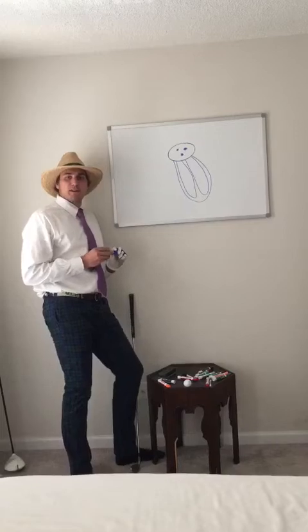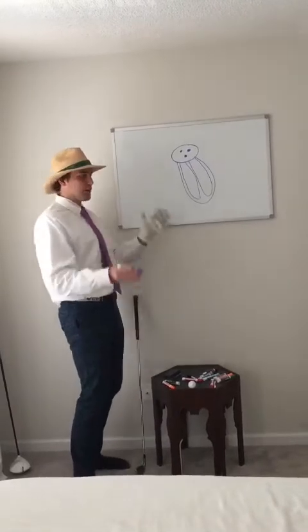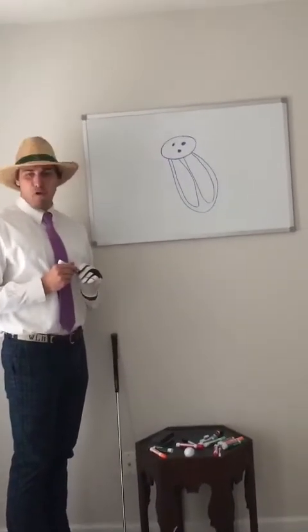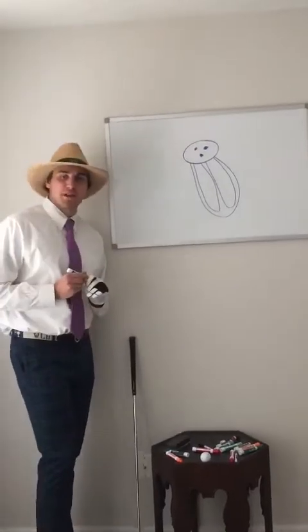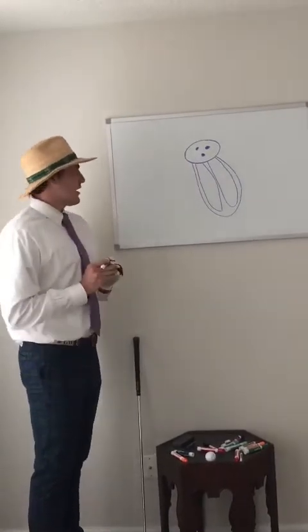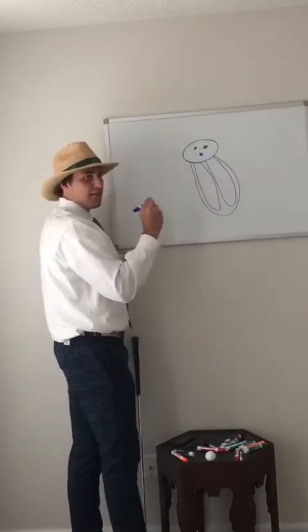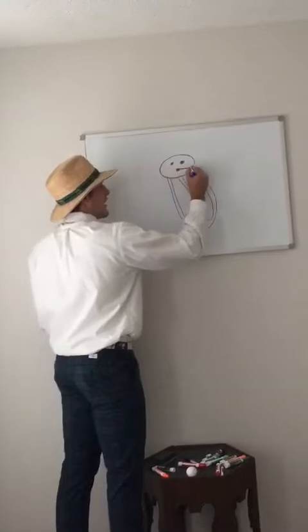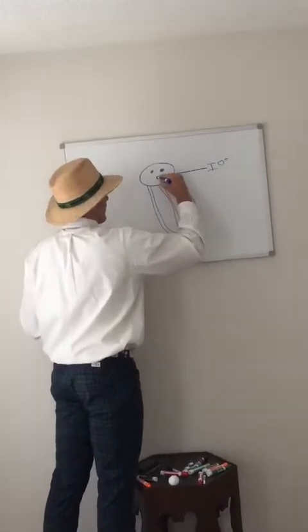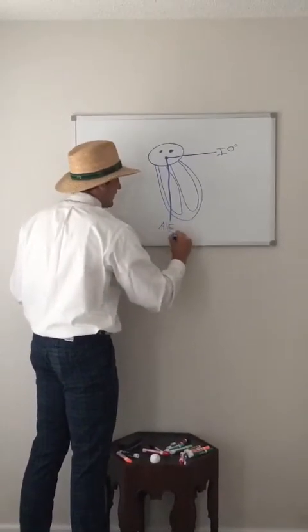And the most fundamental thing about reading EKGs is, well, what in the world am I looking at? I mean, lead 1, lead AVF, where in the world are those in relation to the heart? Here's an easy way to understand it with our world-famous bonehead EKG rat model. Dr. Hicks came up with this when he was in medical school to help him remember what part of the heart he's looking at when he looks at lead 1. As we're drawing the rat model, remember that rats have whiskers. This rat is going to have a whisker that goes out here, known as lead 1, at 0 degrees. The rat's going to have a whisker straight down towards his feet, called AVF, at 90 degrees.